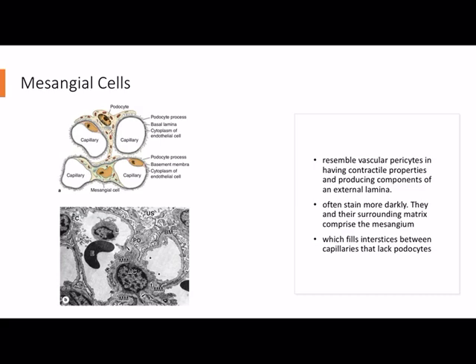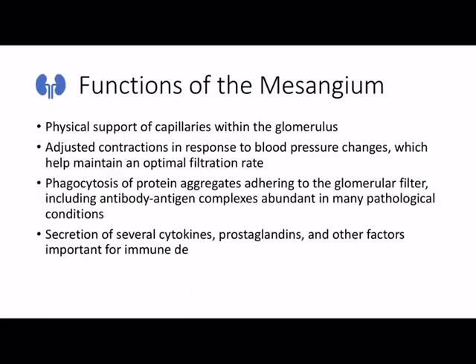Okay? So you will see mesangial cells in between capillaries that lack podocytes. Here you see a capillary with the basement membrane, but the podocyte is not directly attached to the basement membrane. So in between two capillaries, that's your mesangial cells.